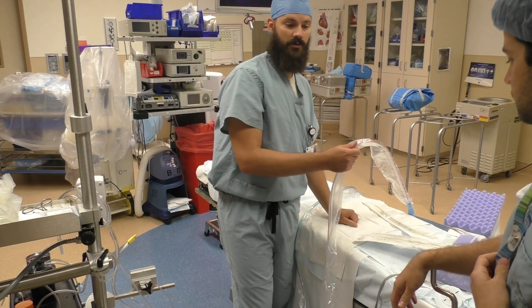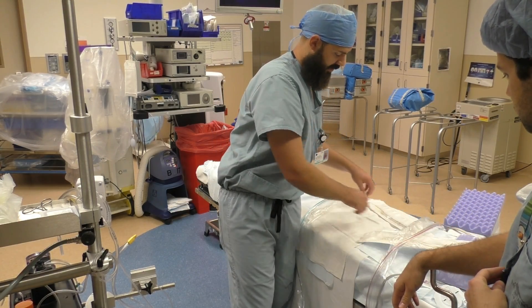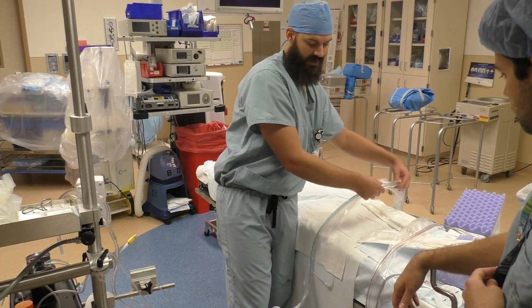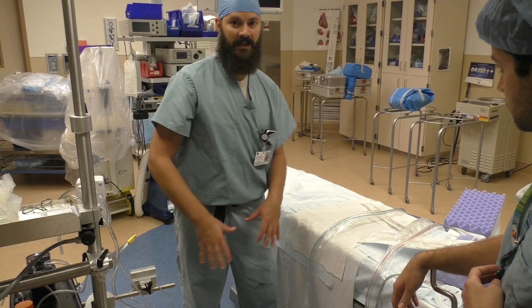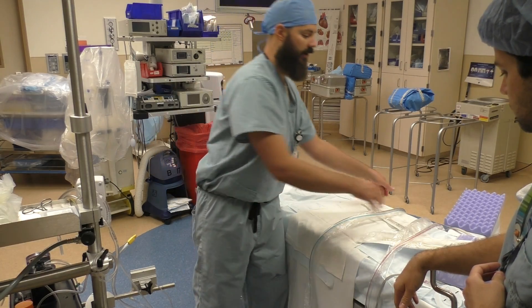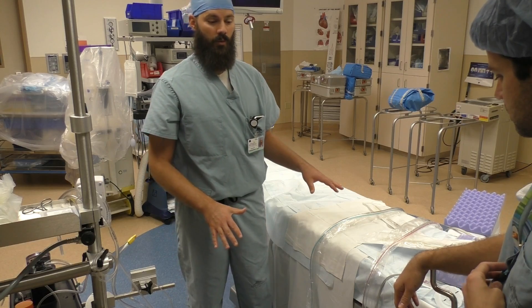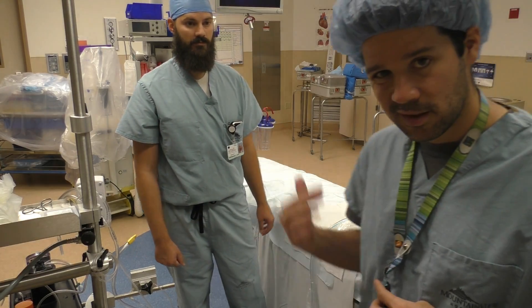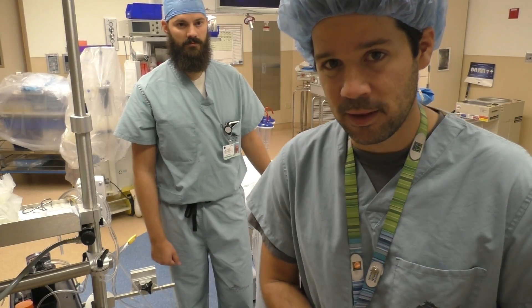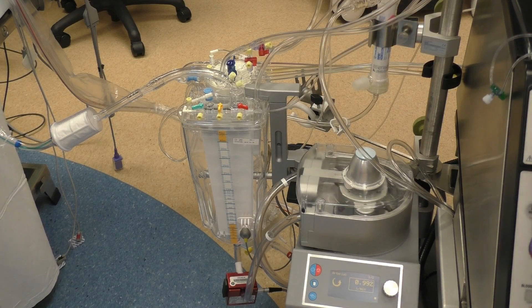At this point, we're going to hook this tubing up to the cannula, and then this side to this cannula, and now the patient is able to be in our loop — they're part of the loop. That is how we connect the patient to the heart-lung machine. So now let's go over that loop that he was talking about. This is where the loop starts — this is where the magic happens.